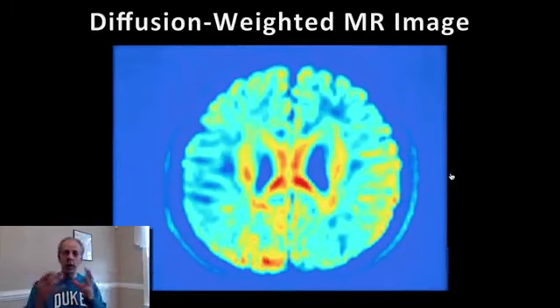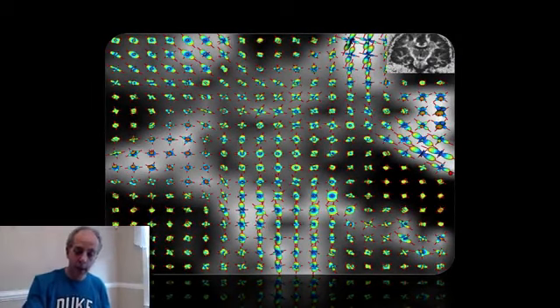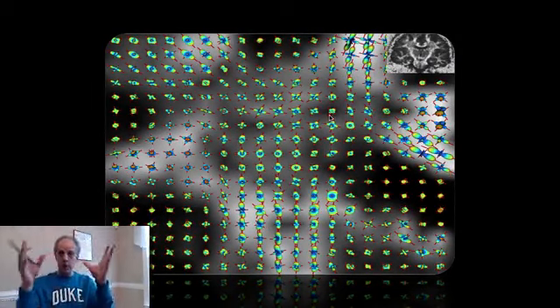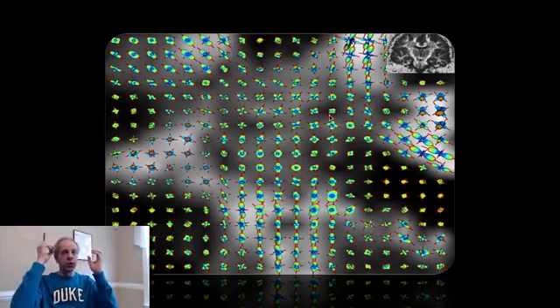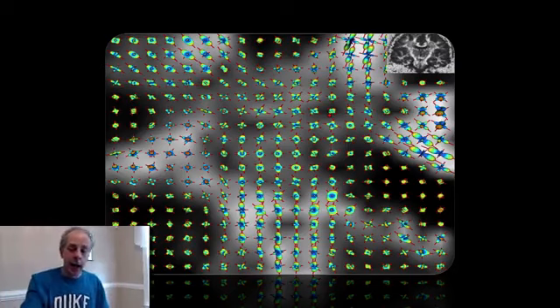So you get all these multiple directions, and from that, as we just said, you get at every single voxel in the image. We are in 3D, our brain is 3D, so instead of pixels, we have voxels. Basically, it's three-dimensional pixels, and this is just a slice of a brain, and we have here a zoom-in version of one of the regions.